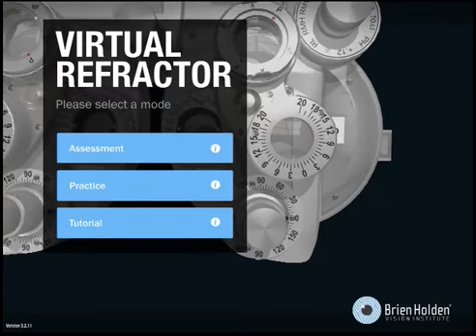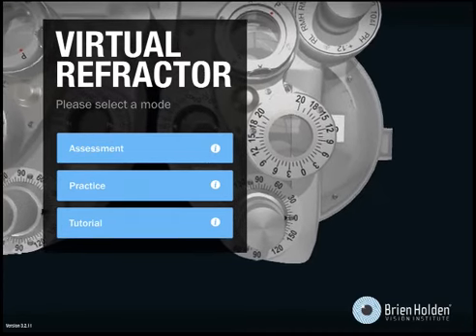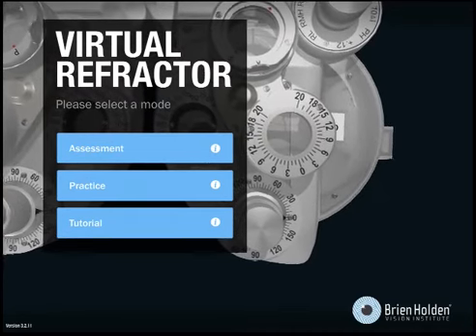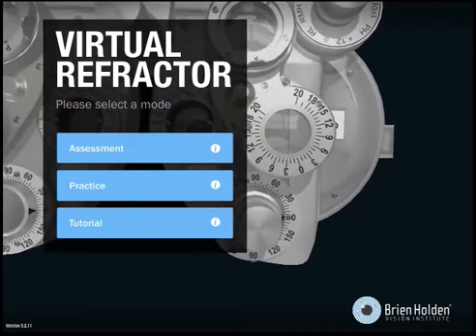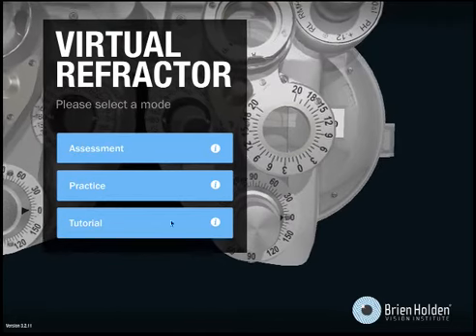I'm here to show you around the virtual refractor. Here I will take you through some practice sessions.